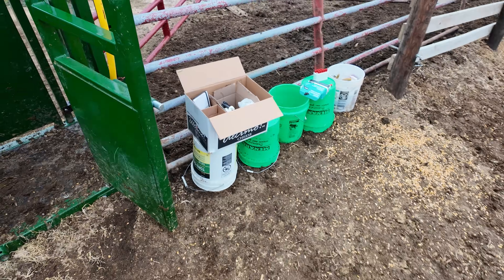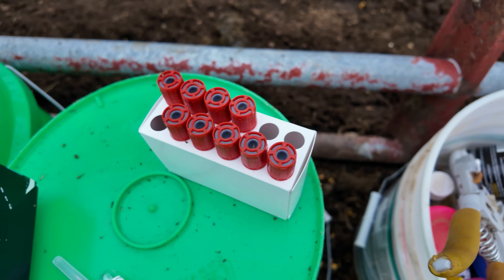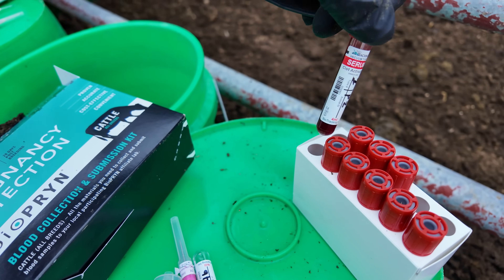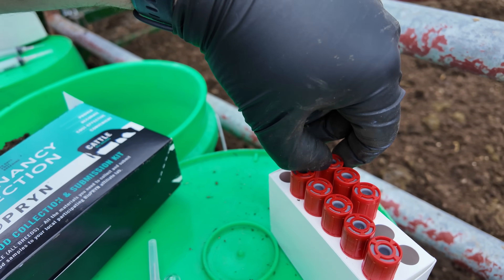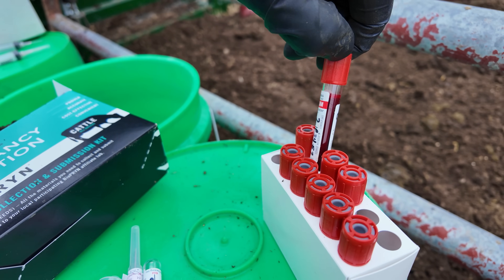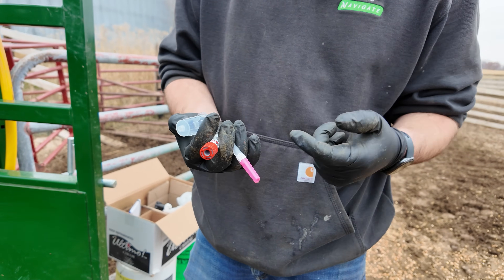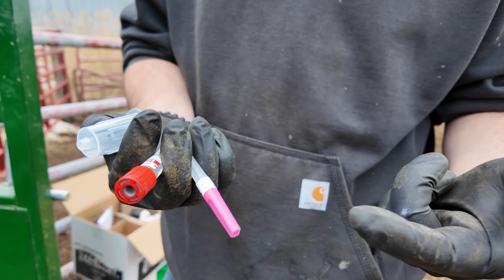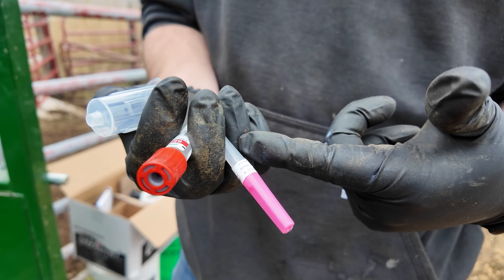We swap out needles for every new cow. Here are our collection tubes — you can see the ones we've already drawn. We've got blood in them, a healthy amount to make sure they have enough to do the tests. We've got our three important pieces: the cup, the double-sided needle. The pink side will go into the cup to pierce the vacuum tube, and the other side goes into the cow's tail.